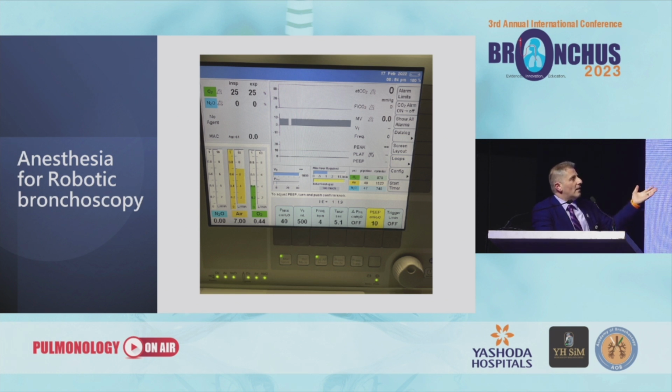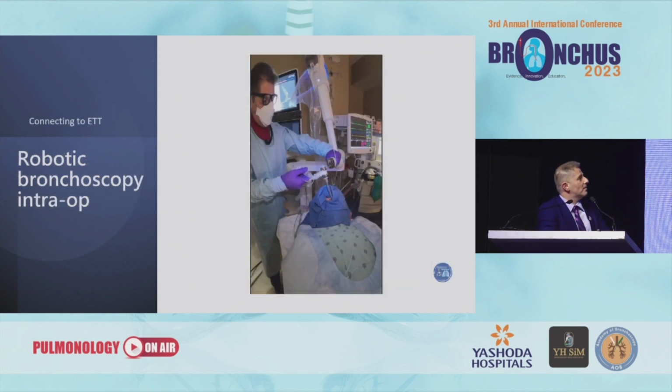And highlighted in a different setup before, but this is a picture where you can see that we look for FiO2 40%, PEEP between 8 to 12, and tidal volumes in the higher part, between 6 to 8 or 10 ml per kg ideal body weight. We also request TIVA and full paralytic agent throughout the procedure.